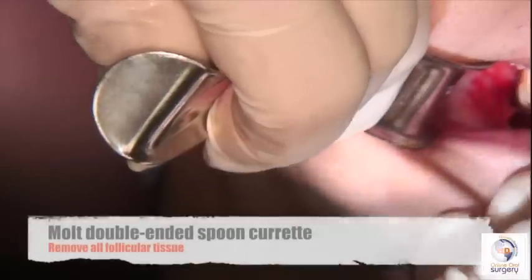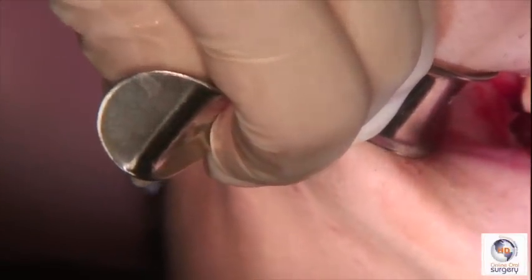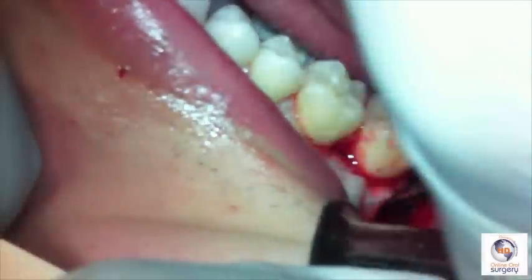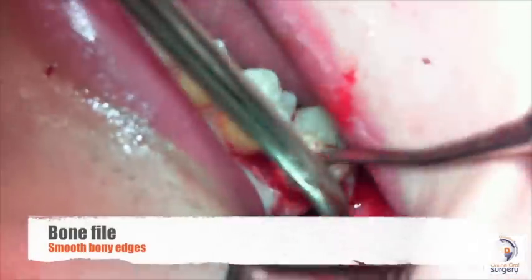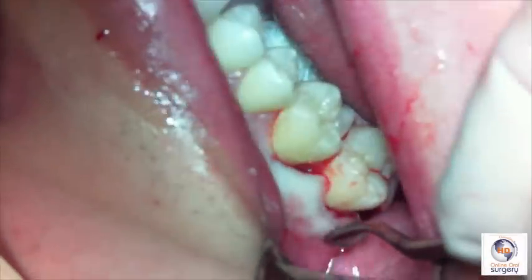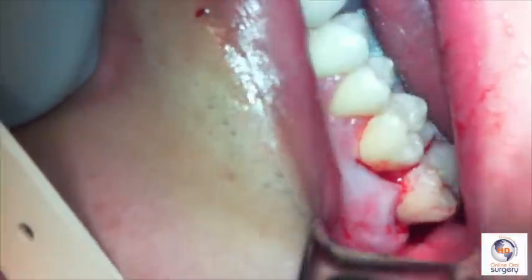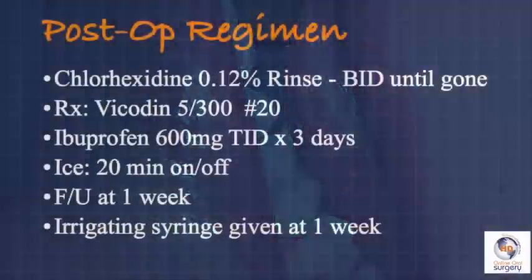Clinically you can see the 46R elevator in place. We find a good purchase point, rotate the elevator, and this moves the tooth distally and buccally out of the socket so we can grab it with a curved hemostat and remove it from the mouth. In this case, we're lucky enough that the follicular tissue is still attached to the tooth. We then come in with our molt double-ended spoon curette to thoroughly debride the extraction socket, making sure we've gotten all the follicular tissue out using a combination of that curved curette and a mosquito hemostat. We take our bone file again to smooth off any rough edges under copious irrigation. Most of the time this tissue will lay very nicely by itself and the cheek will hold it in place, so it's not really necessary to put a suture for the majority of maxillary impacted third molar teeth.